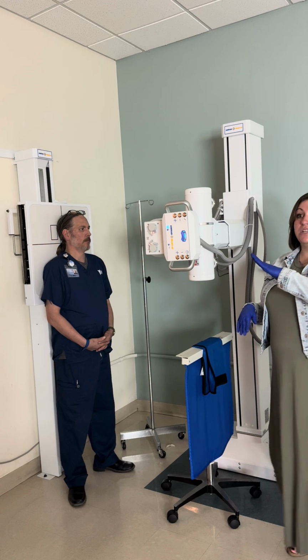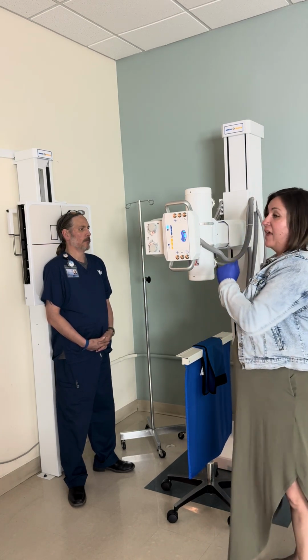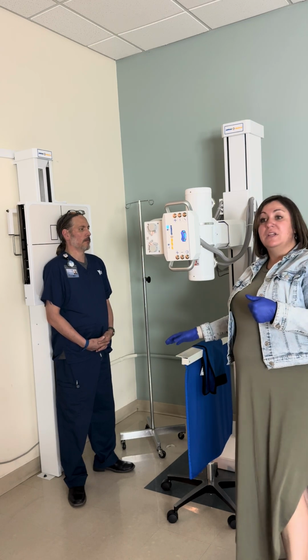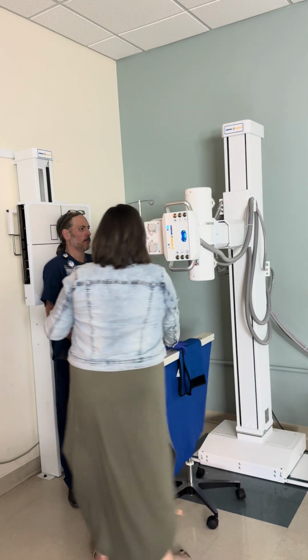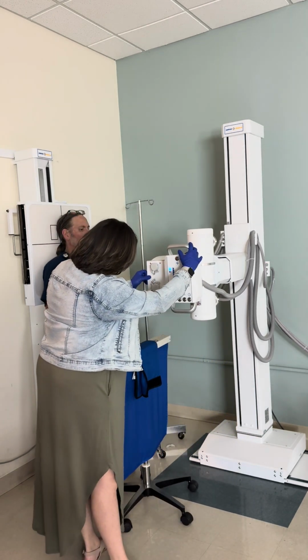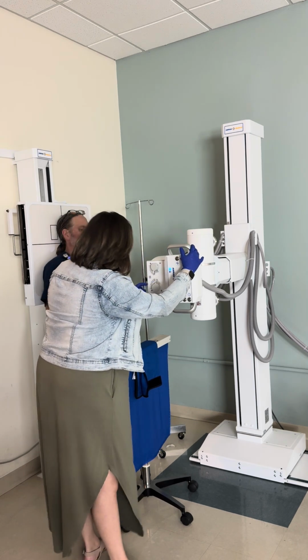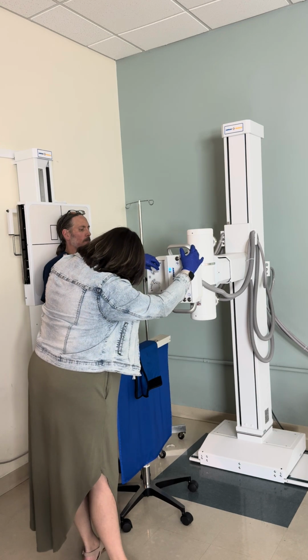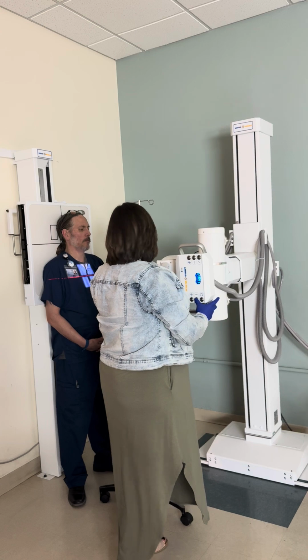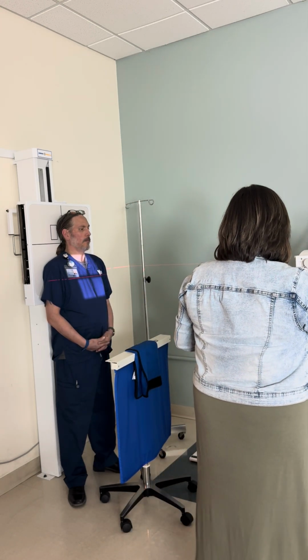Say P-axial 15 degrees at 40, and we do the picture and then take the angle off, and now we're centered in the middle of the mouth. Okay? For the lateral, we're going to go out to 72 inches. And we're still 10 by 12, so we're gonna open back up now to be 12 top to bottom on the 40-inch line, and 10 side to side on the 72-inch line. So, out to 72 here.